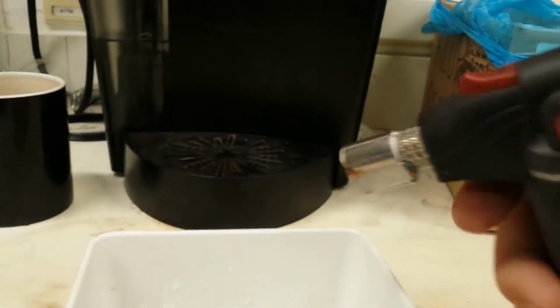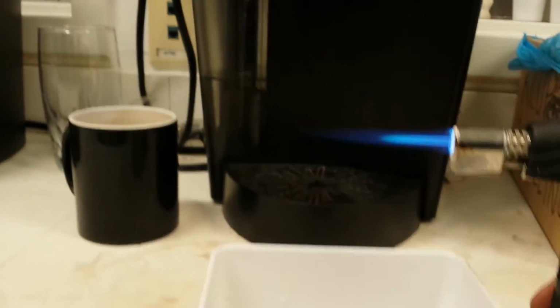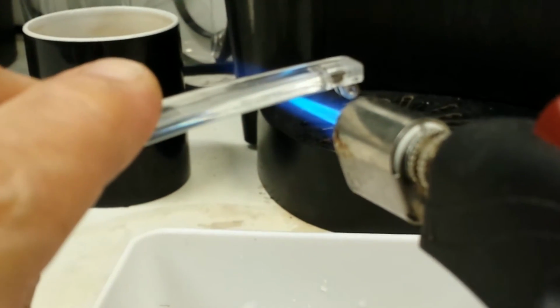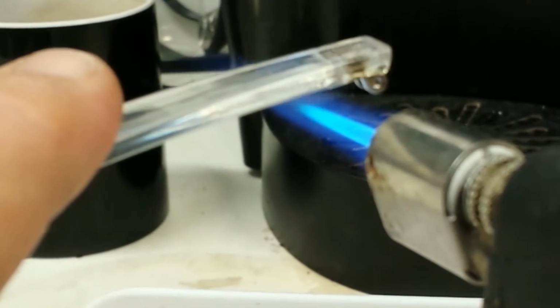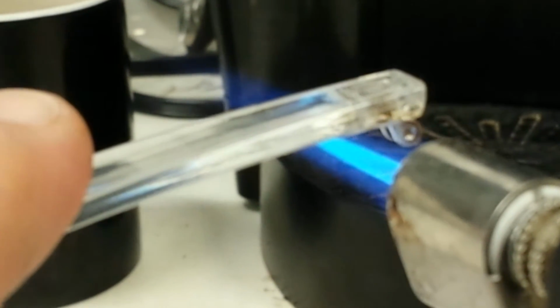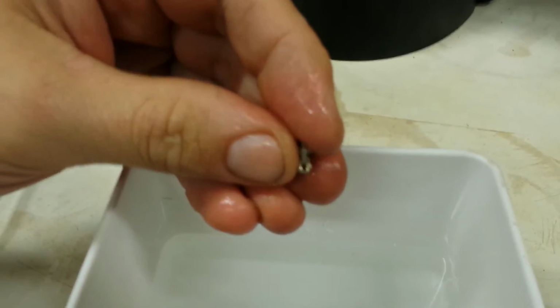So I've got my little torch here. Okay, and whoa, don't point that at the phone. So now, just gonna hold this right there. And, don't wanna get it on fire. And, ta-da! Look at that. That's perfect.